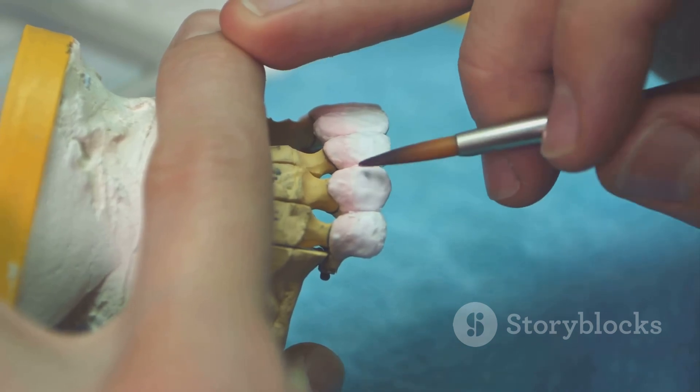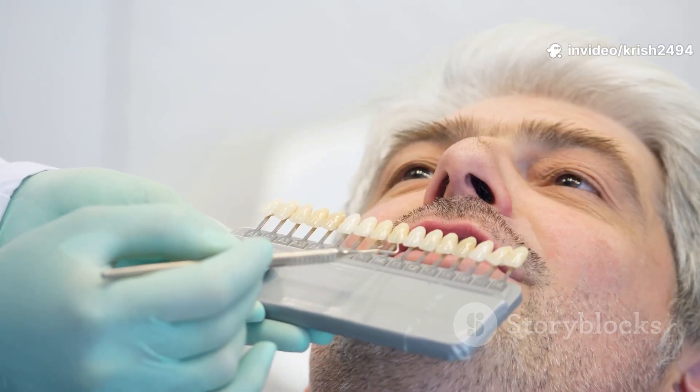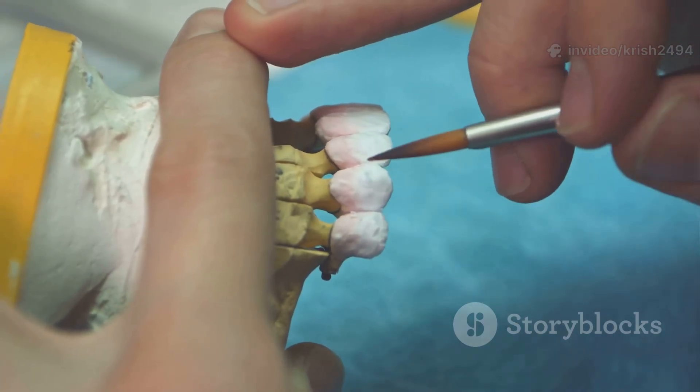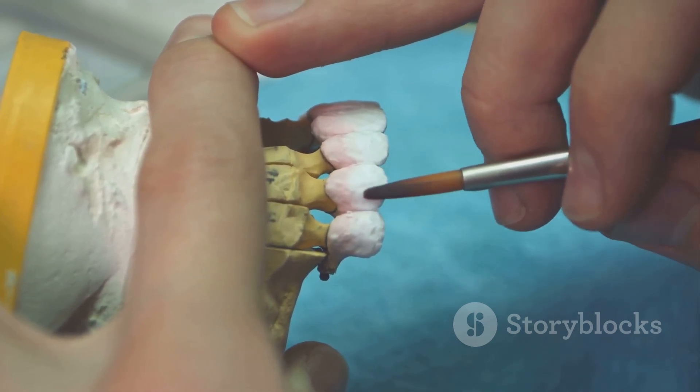Now for the fun part — teeth selection and arrangement. The dentist picks the size, shape, and color of your denture teeth, matching your age, face, and even your personality. The lab sets these teeth in wax, following a specific bite pattern, to create a wax trial denture.